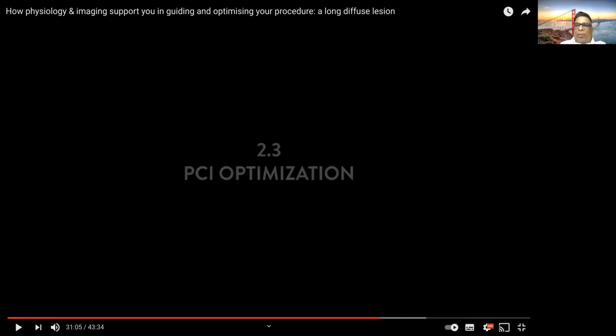The initial OCT was difficult, so they used a GuideLiner to push the OCT catheter in. Then they did rotablation, then balloon dilatations. After rotablation, on OCT they could see a proximal dissection of the LAD caused by the GuideLiner.